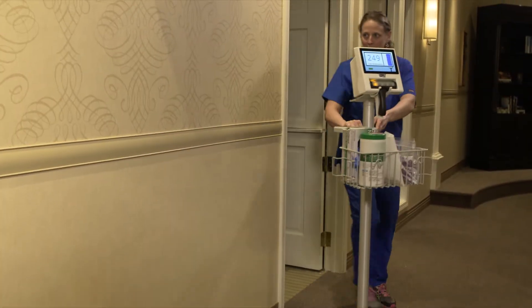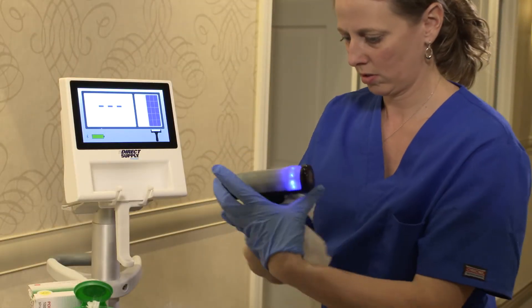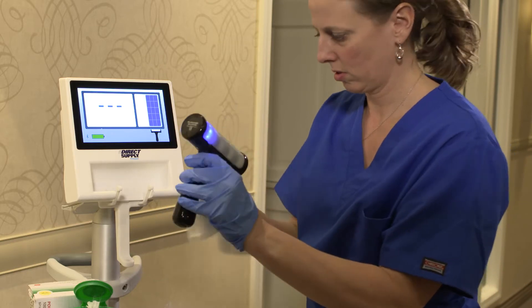To clean the Attendant Prodigy Bladder Scanner, it is recommended that after each use, you wipe the scanner probe with a soft cloth or towel to remove excess gel.